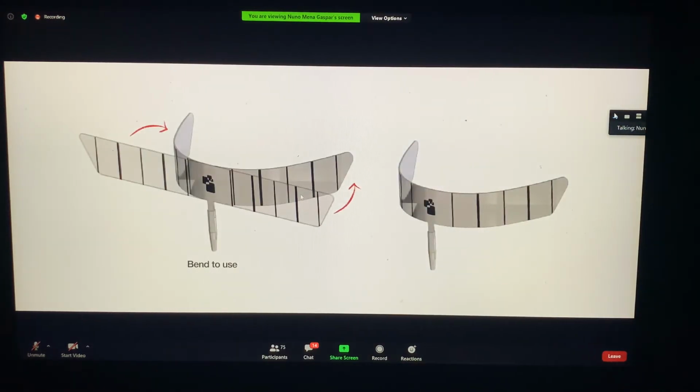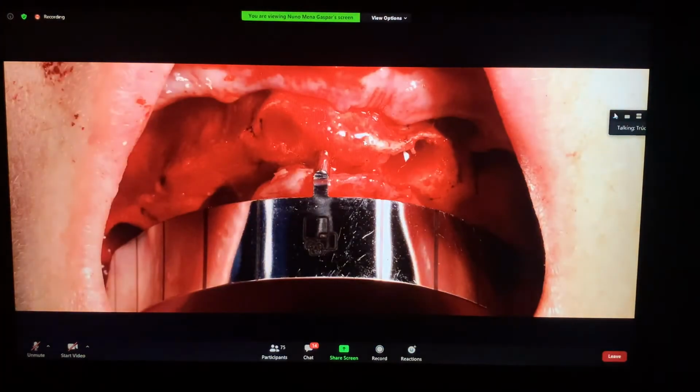This is the Megagen Polonex guide, and this has markers at 7 millimeters between them. Okay, and here we will have a 30 degree angle. Và tôi dùng cái thước này để mà canh.